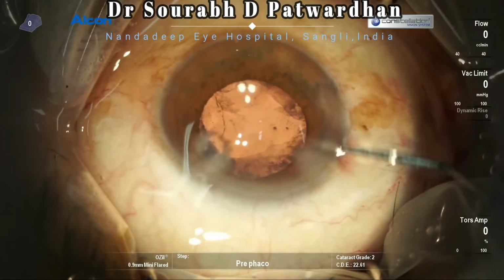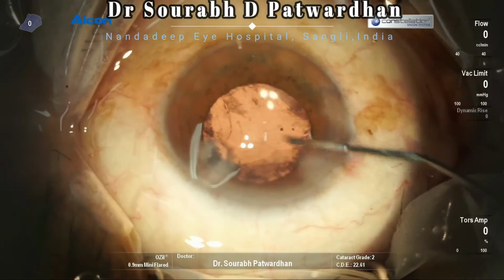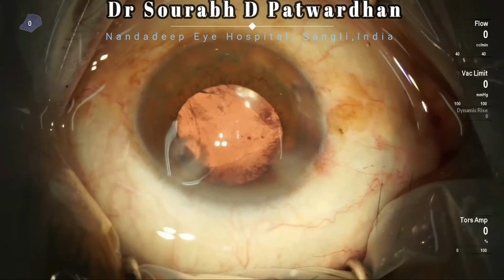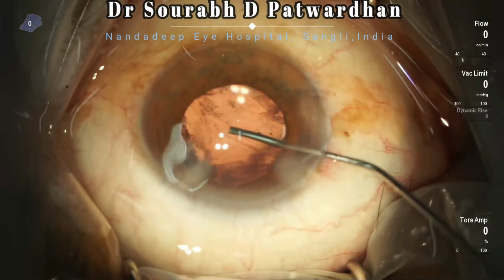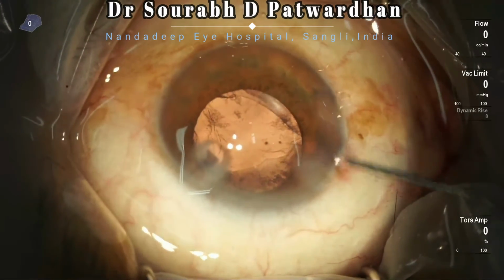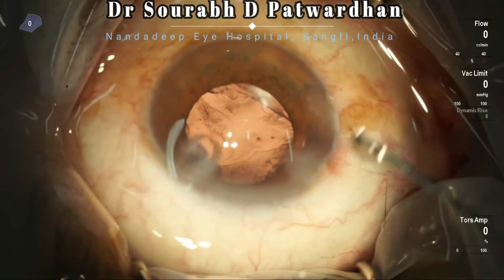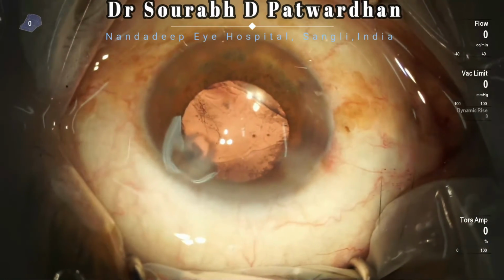In this particular patient, I would like to start immediately on some anti-glaucoma medication and more frequent steroids to take care of the initial inflammation, but the post-operative visual outcome as well as the refractive outcome will be excellent. The rest of the visco I am just trying to wash off a bit, not trying too hard, because you have to be very careful not to make too many AC fluctuations and cause extension of the rhexis here also.